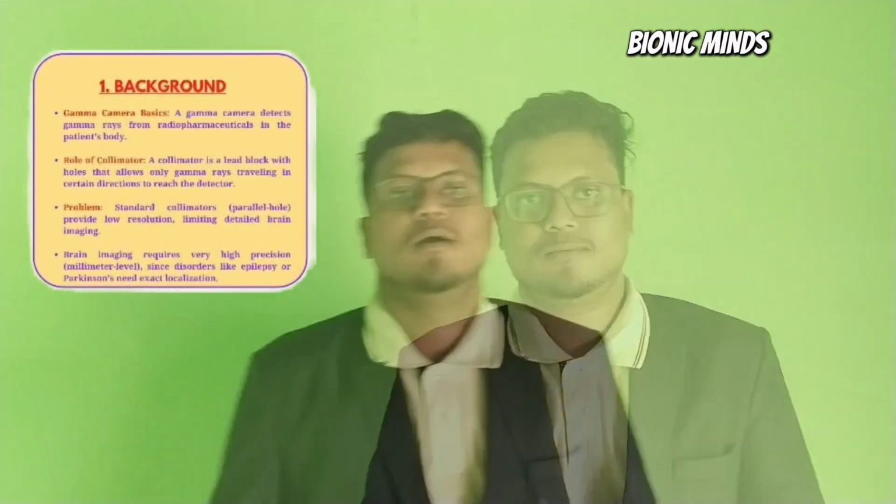Welcome to this case study presentation on innovations in collimator designs for high resolution brain images in nuclear medicine. Have you ever wondered how doctors get such clear images of our brain using nuclear scans like SPECT? Well, the answer lies in small but powerful devices called collimators. So let's begin with the background.